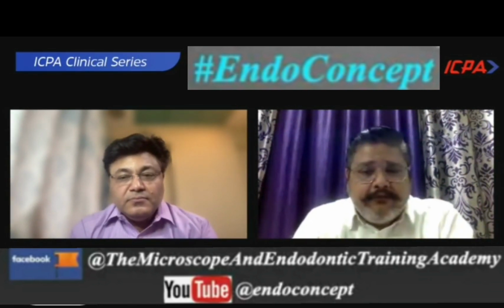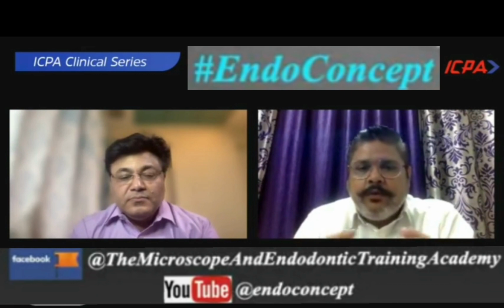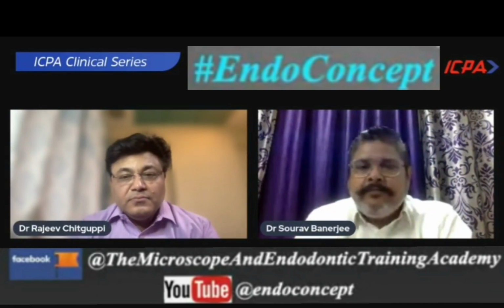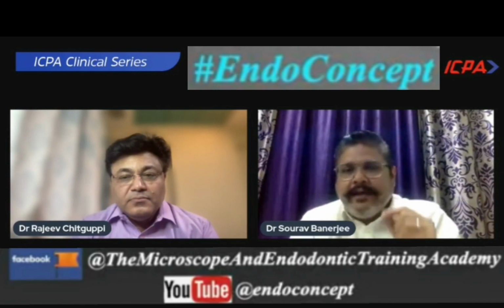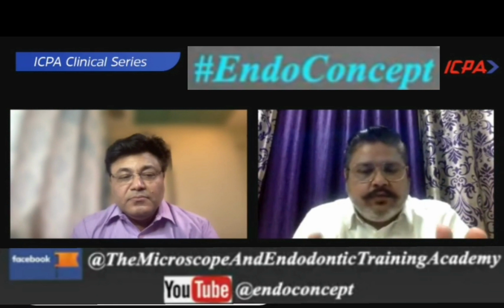For example, in vital tooth, in calcified cases, when we just clear off the bulk of calcification, we can make out red spots or the bleeding spots from the canal through the microscope. So we can easily pinpoint, we can operate in that area and open up the canal. So this is one way.